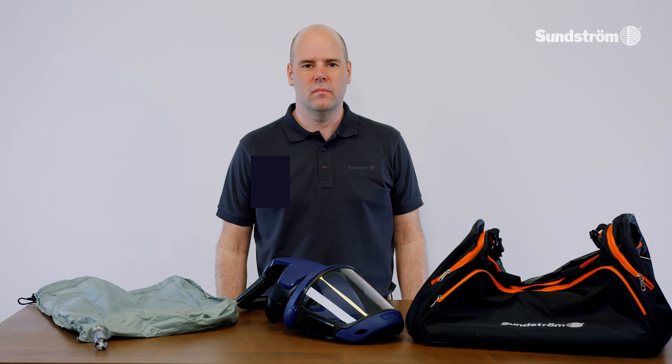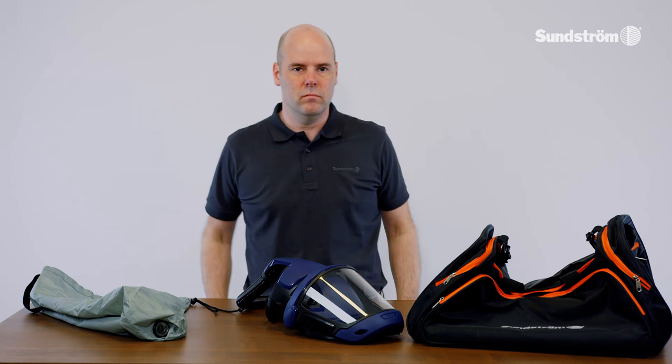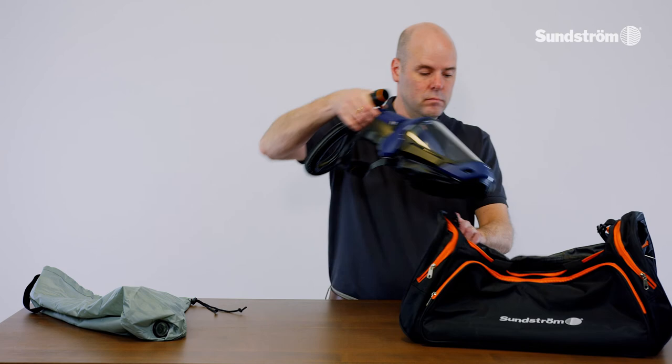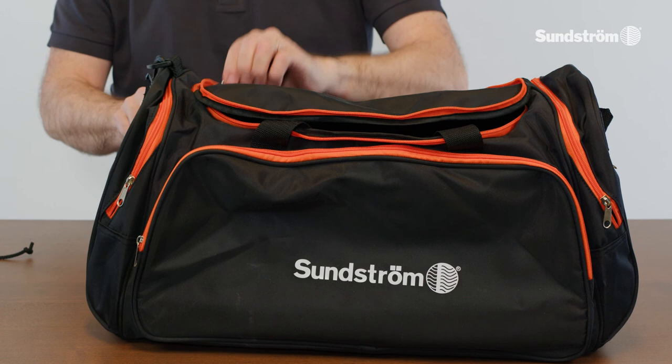Storage after cleaning: store the equipment in a dry and clean place at room temperature. The flow meter can be turned inside out and used as a storage bag for the head top and the fan unit. Store the face shield with the visor in the fully raised or fully lowered position and avoid exposing it to direct sunlight. An alternative is our SR 505 storage bag.